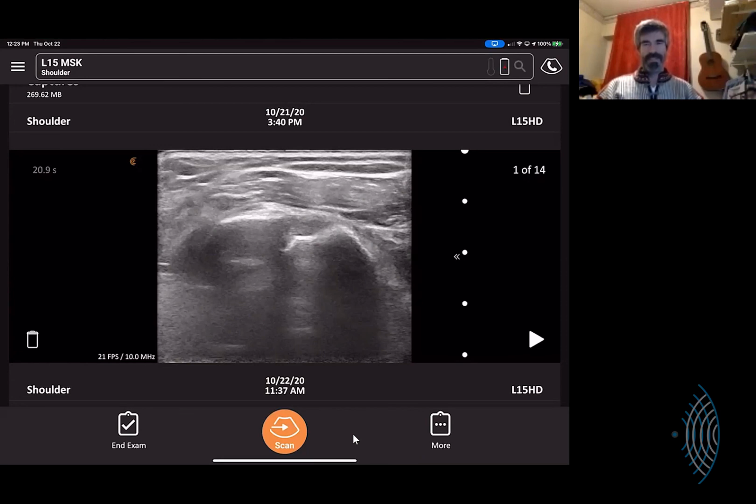Yep. What I want to show you again, and this is the vulnerability thing we talked about, this is going to be a short axis scan of the humerus. I'm going to be trying to follow the long head of the biceps up and over through the groove. I ultimately want you to realize that this was one of those occasions where I found a large black mass, or should I say a hypoechoic area in the bursa, and it was uniquely located next to or near the subscapularis tendon. Yet I did not see much coming around.